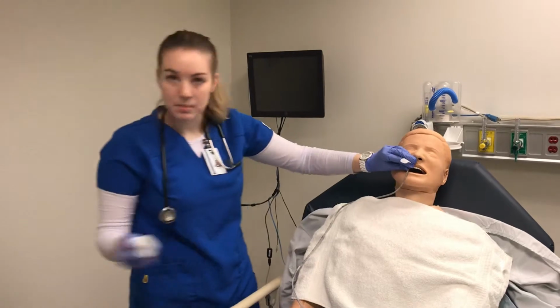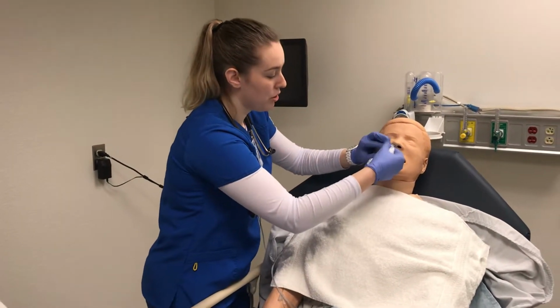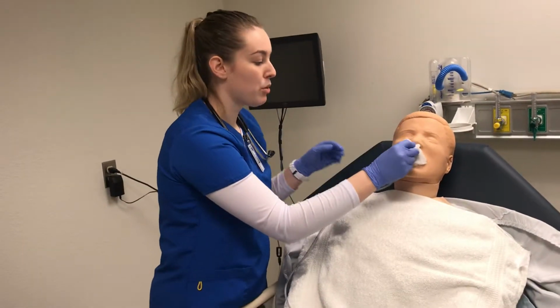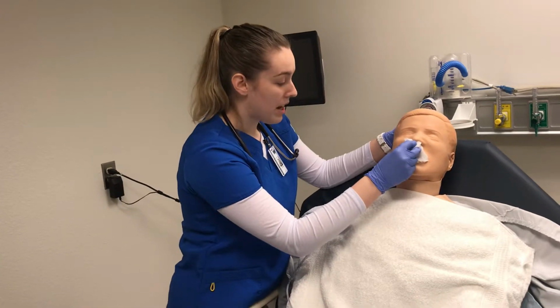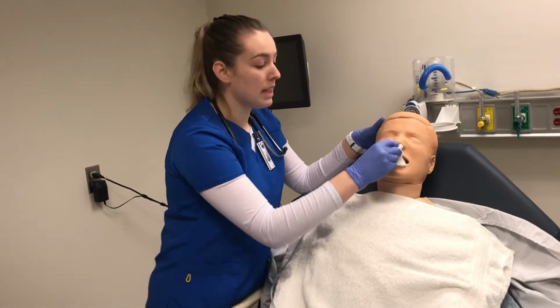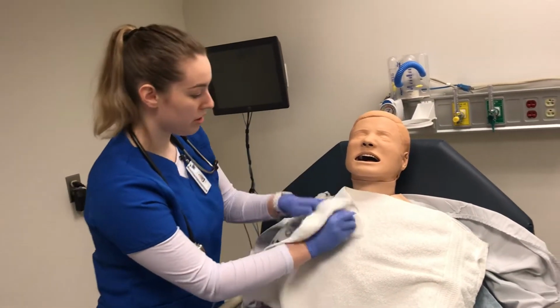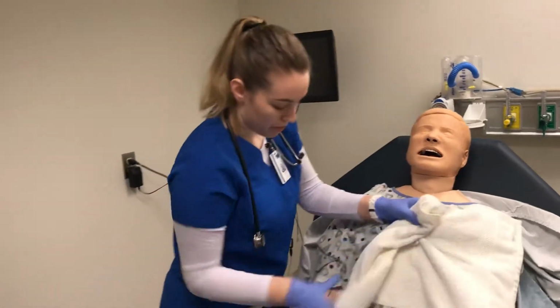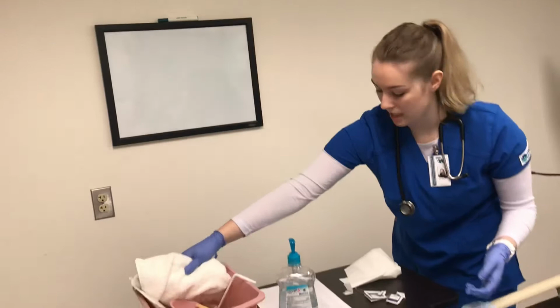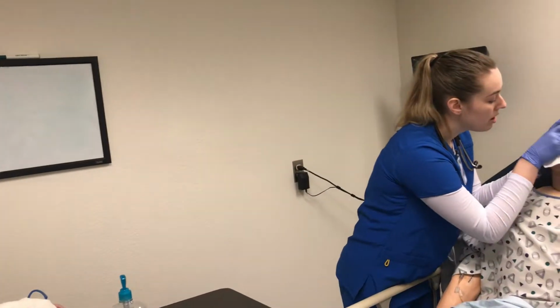Okay, Shirley, so I'm going to take my gauze and I'm going to wrap it around the tube. So I have some grip. Okay, Shirley, I need you to take a deep breath and then hold it. Okay, so she's taking a deep breath and now she's holding it, and I can just pull the tube straight out. Good, okay, and it's out now, Shirley. And then I would wrap it up into a towel and dispose of it as per facility policy in a biohazardous container. And then I have another towel just to clean up Shirley's nose.